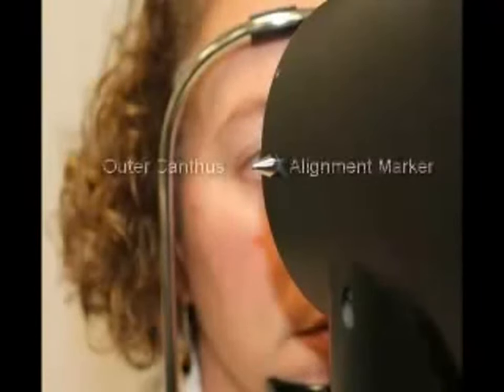The next step is to align your patient. With the chin resting in the chin rest, turn the chin rest elevation knob up or down so the center of the patient's forehead is resting against the forehead bar. Once the patient is positioned comfortably, align the keratometer to the patient's right outer canthus. Move the elevation knob up or down so the alignment marker is aligned with the outer canthus. Once this is done, occlude the left eye.